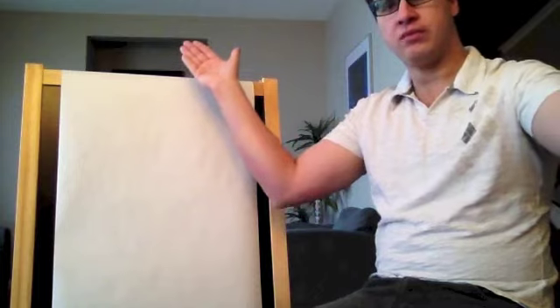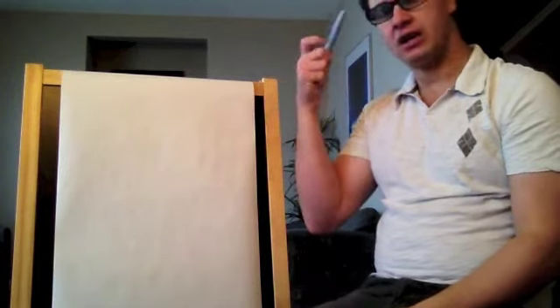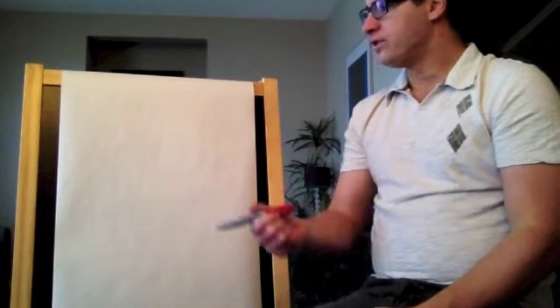So that would be a lead, and that would be more like a 12 lead. It's really important to understand this, because a lot of people sometimes don't modify the monitor, and we'll talk a little bit more about it towards the end of this video. So to understand, it's a picture.